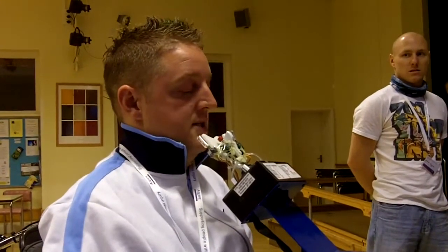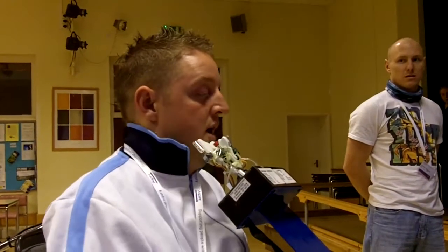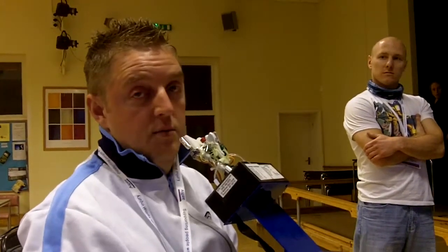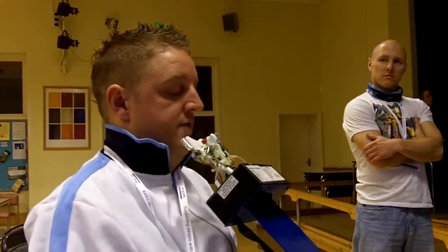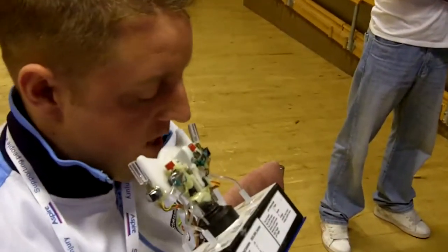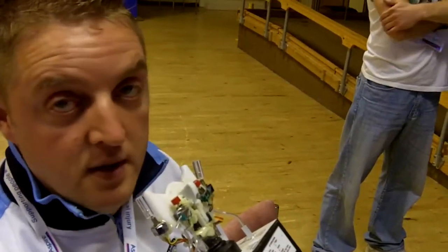Basically, what you're looking at here essentially is a replacement for people who have no arm or hand functional movement, who can't use the hand-controlled device. What we have is a device for the Xbox 360, and this system here, developed in America, effectively achieves the same thing as a hand-controlled device by using two separate functions. The first is pressure switches, which, if you look on top here, I can control either using my lip, my tongue, or my mouth. And secondly, two functions of sipping and puffing.